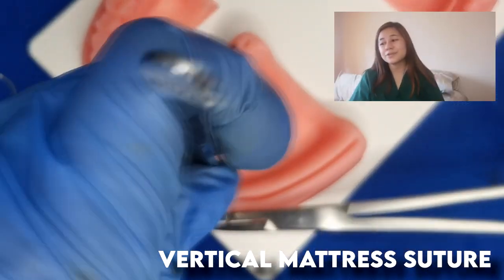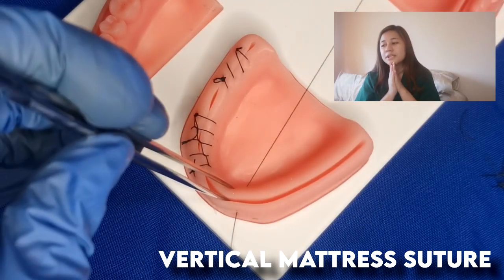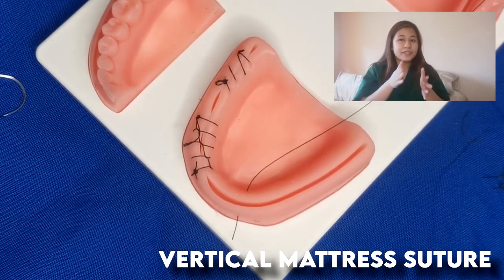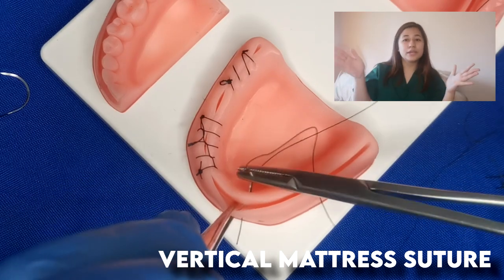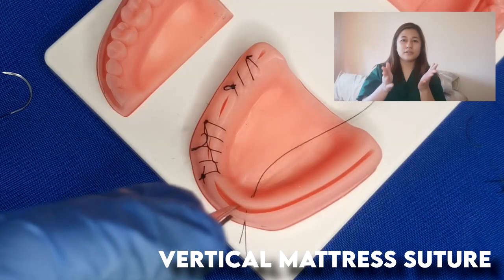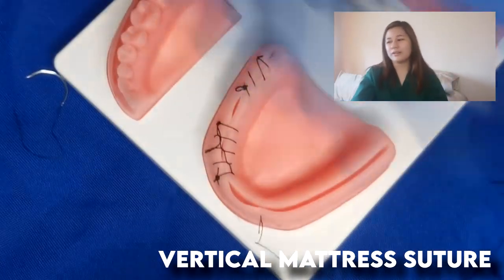And this one is the vertical mattress suture. The vertical mattress suture is the far, far, near, near technique. As you can see, I'm doing from buccal to lingual, far, and then lingual to buccal, near, near. Then I do my knot already.